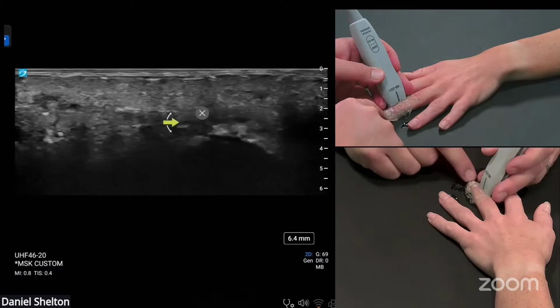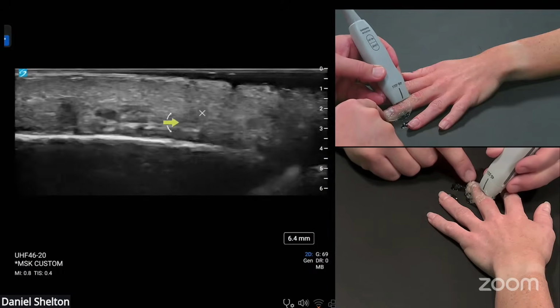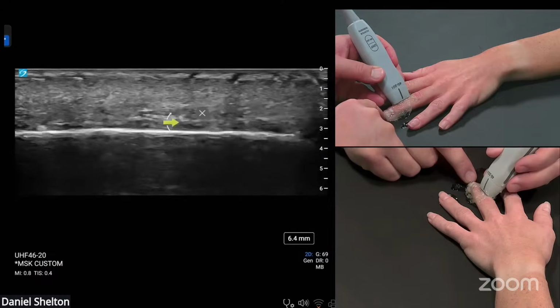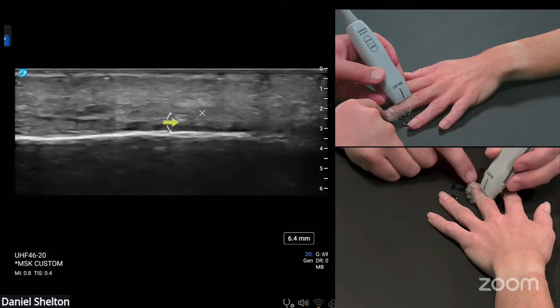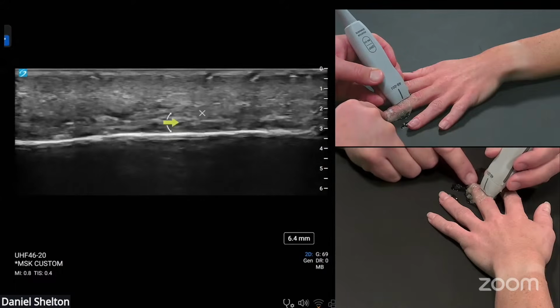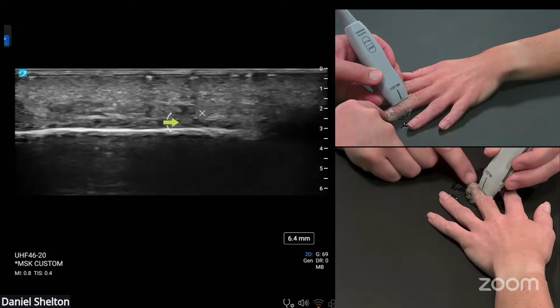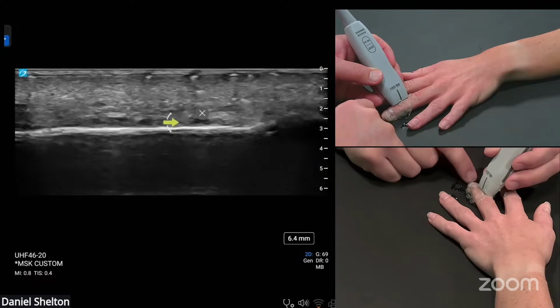Then move the nail and make them move, because this is ultrasound, we're going to make it move. Then you can follow those fibers right there, right where my arrow is. So that was lucky. And you can see how far on the side of the phalanx I am. I'm not mid-sagittal to the phalanx, and I'm seeing those fibers move real nice.